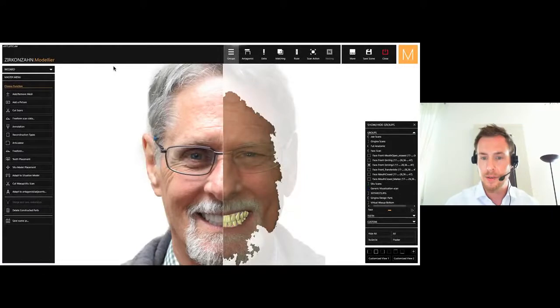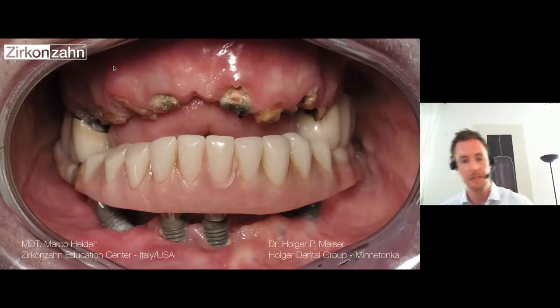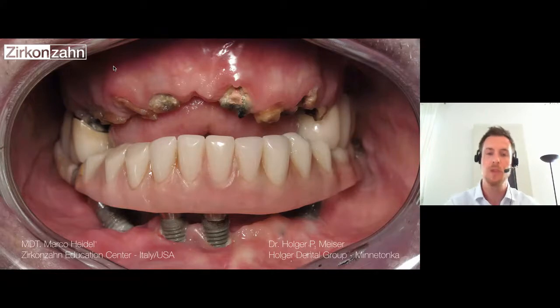Okay, let's go to a case I did with a doctor from America, Dr. Holger Meiser. He's German as well, but he has lived in the USA for years, and I worked with him to do some cases to try out new stuff in patients' mouths: materials, components, and all those things. And this is one of the cases we did.